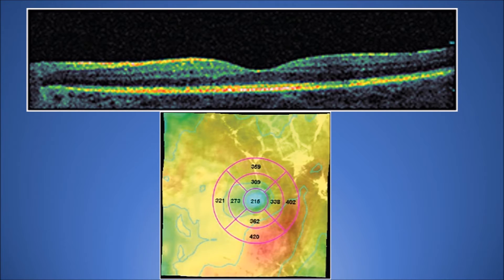This OCT is for the same patient after receiving four intravitreal injections of bevacizumab. As seen in the upper image, macular thickness is reduced. The second image shows a reduced central macular thickness with residual extrafoveal thickening, which requires focal laser treatment.